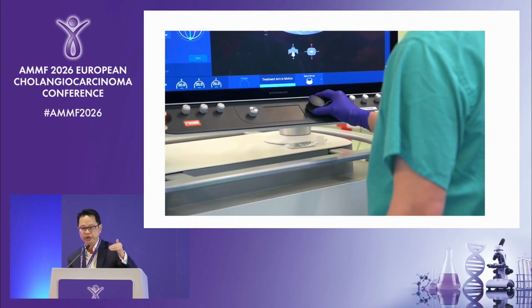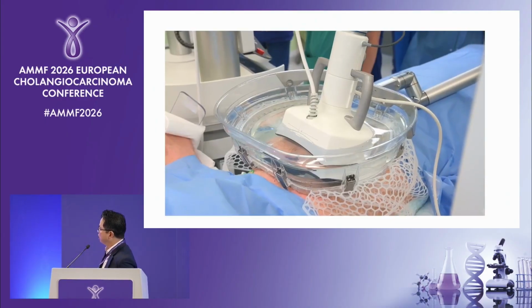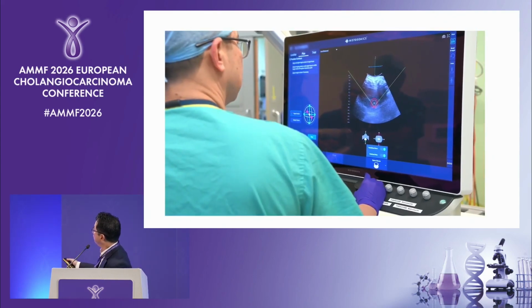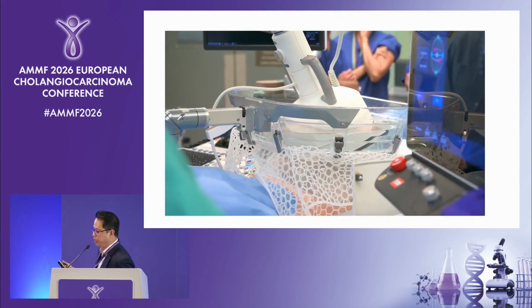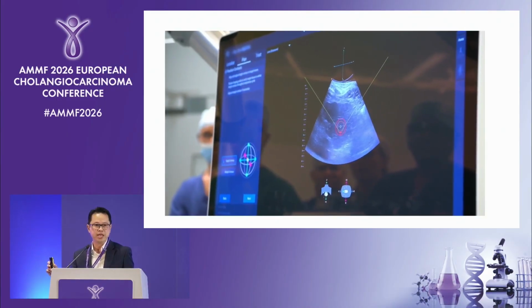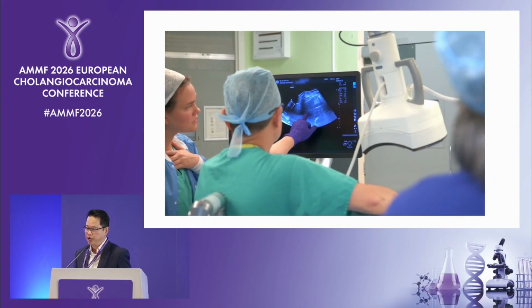You can increase or decrease the depth. And then you will contour the area of the treatment zone that you want to do. So for example, the orange here is a treatment area, and you will create a margin of at least 5 millimeters around it to make sure you have the appropriate margin.